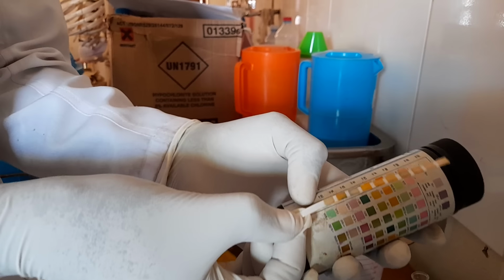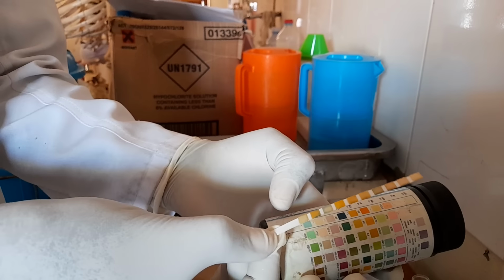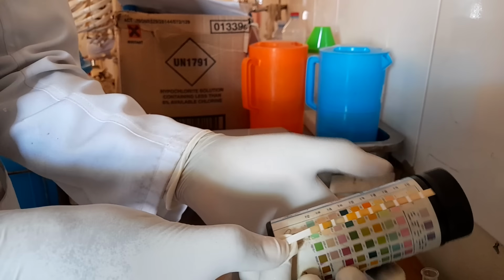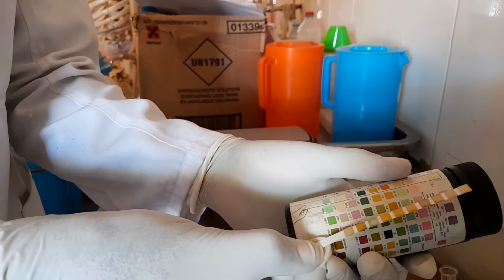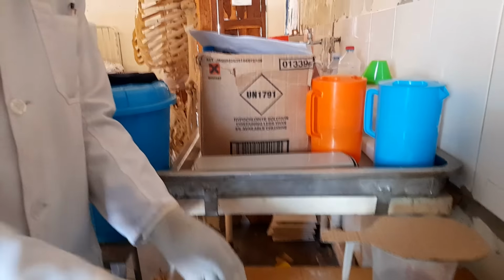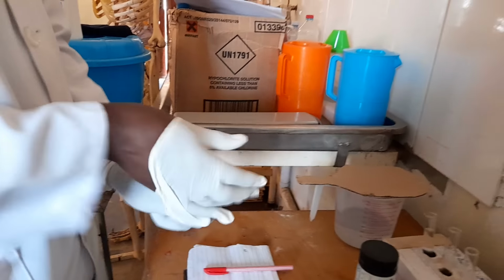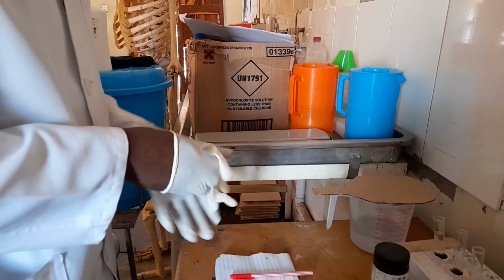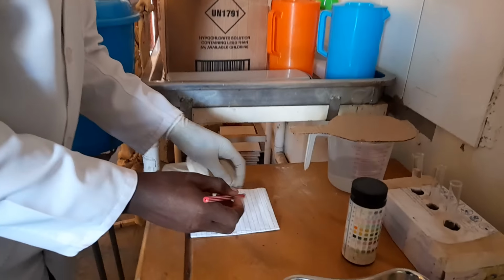So you start from the bottom going upwards, because the time you get to 30 seconds, 30 to 120, meaning the time will be 2 minutes by the time you finish reading. So that's how you read. At this moment, you can even document and report to the ward in charge. So you're going to write whatever you got. Now you can take off this glove and document.